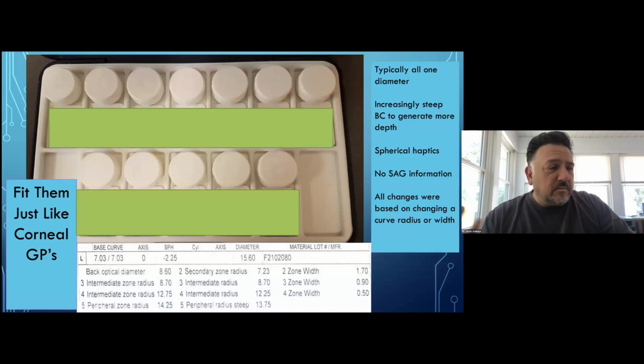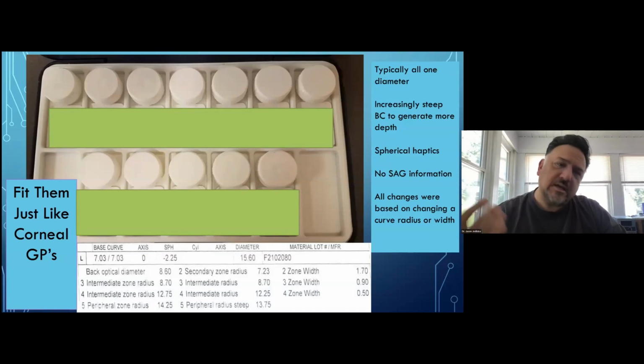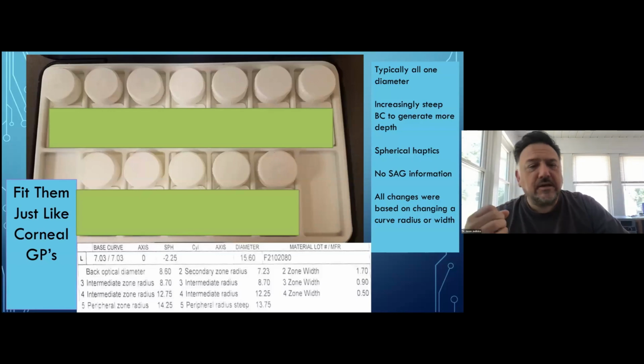No sag data. I remember some of the early sets saying, can't you put the sag information on my invoice so I know exactly how many microns of depth? They said, well, we actually really can't do that because it's not part of the software, and we're not able to put that parameter on there. Okay, so obviously a lot of that has changed now. And so again, as we've evolved through moving towards a different mentality of thinking, away from base curve, away from curve widths and radii, to just clearances and heights.